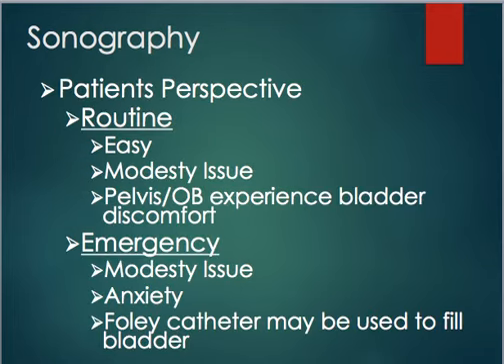Patient perspective for ultrasound. Most patients feel like it's pretty routine. It's easy. There is the modesty issue, especially when we're looking at cardiac ultrasound. If you've ever had a cardiac ultrasound or known someone that has, they're looking right at your breast tissue, so that is exposed during the procedure. So try to do the best you can to give your patients modesty. For pelvic or OB, they can experience bladder discomfort, like I said, which can be very uncomfortable for those patients. So keep that in mind when you're scanning them.